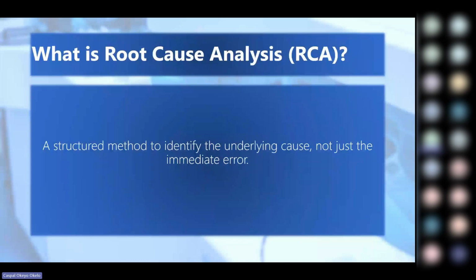It must rely on documented records, your QC charts, maintenance logs, SOPs, and it should not rely on assumptions. If RCA becomes guesswork, it loses credibility. When done properly, RCA will transform an EQA outlier from a failure into a quality improvement opportunity. And this is the mindset I want us to build.